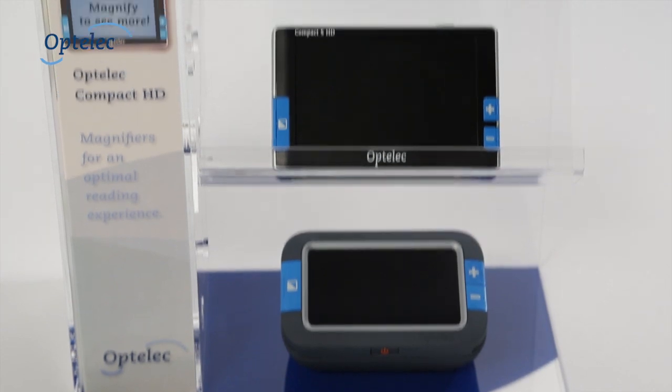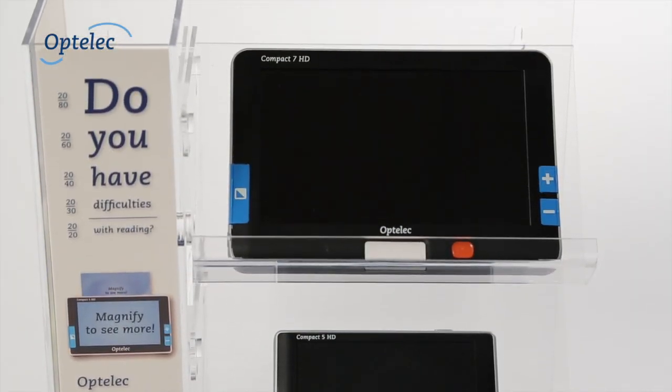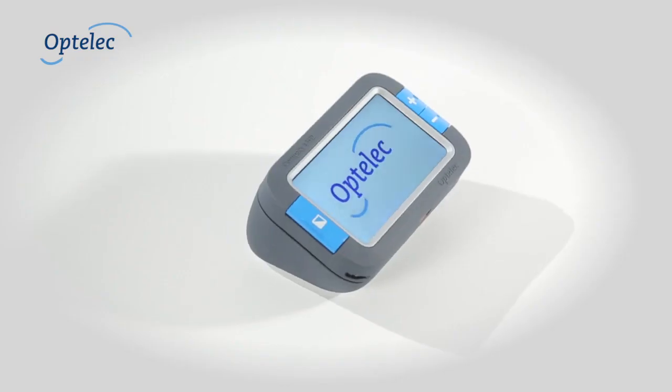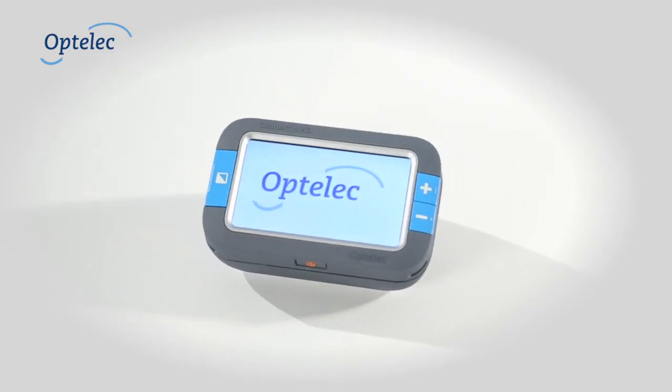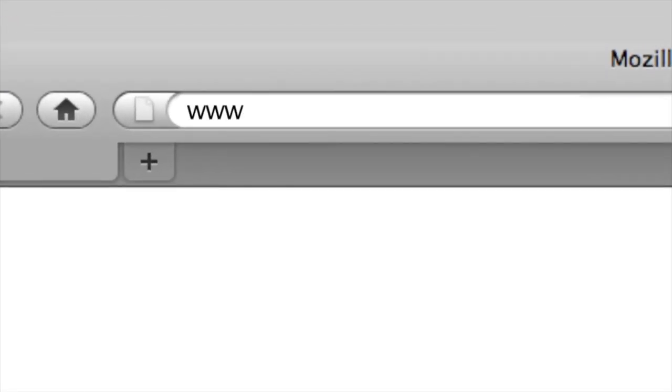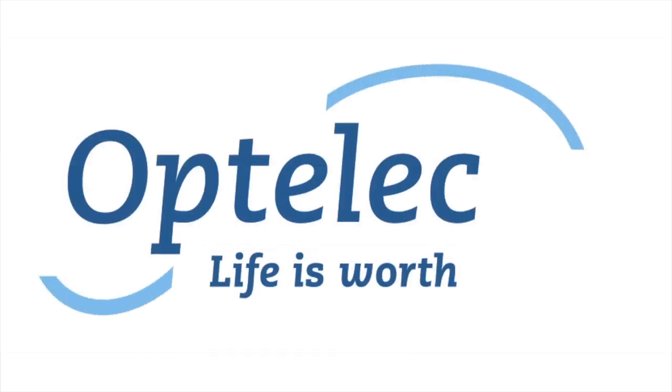The Optelec Compact 4HD is the newest and smallest member of the Optelec Compact HD family. The Compact 4HD changes your ability to read again. Want to know more? Visit our website at www.optelec.com. Optelec — life is worth enjoying.